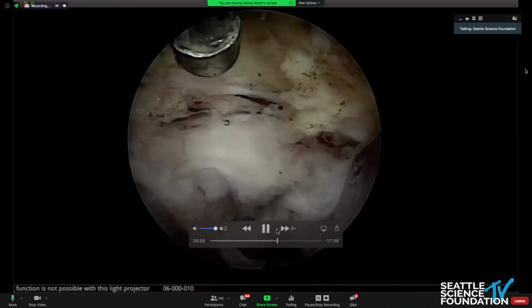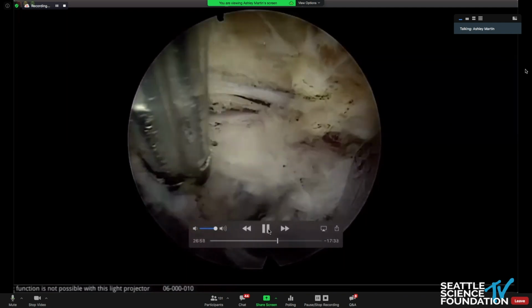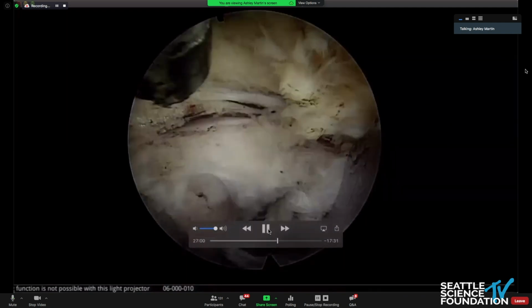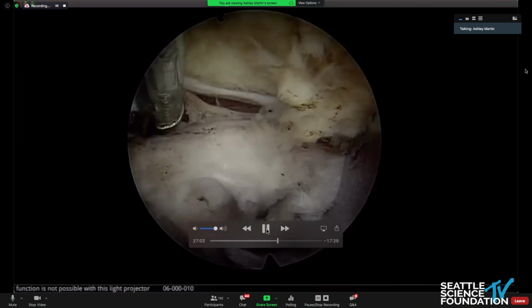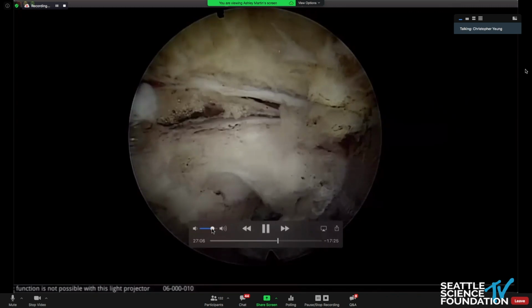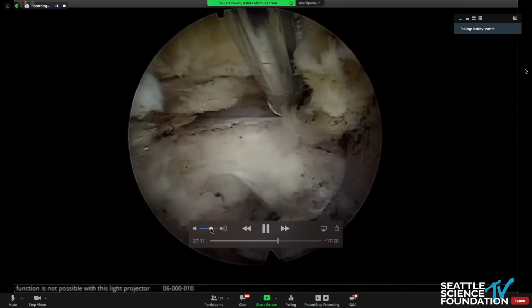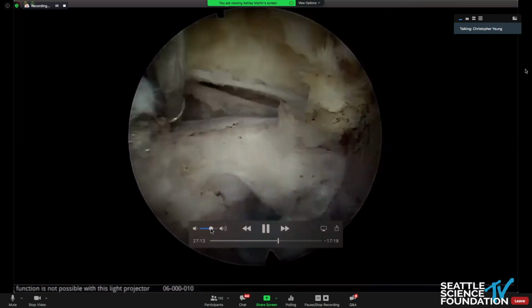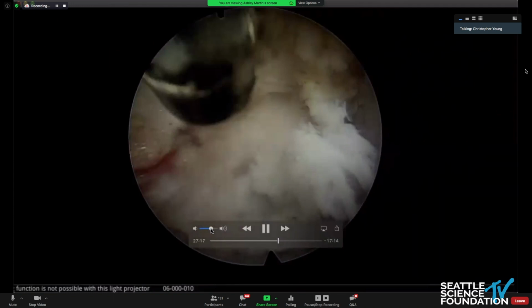There's another question from the audience, Chris, asking if you have used osteotomes or chisels to trim the facet. Really nicely right here. Give me an extra picture right there. It would not necessarily be an osteotome, but what we call a trephine. It's circular, and we'll use that. So here's that traversing nerve root, nice and free, as you can see.